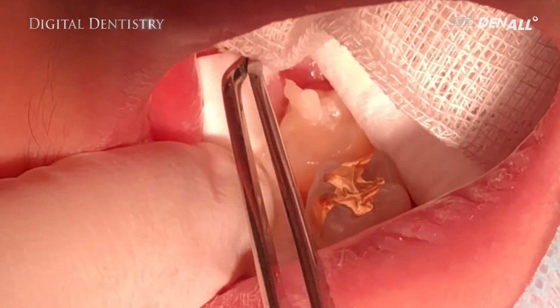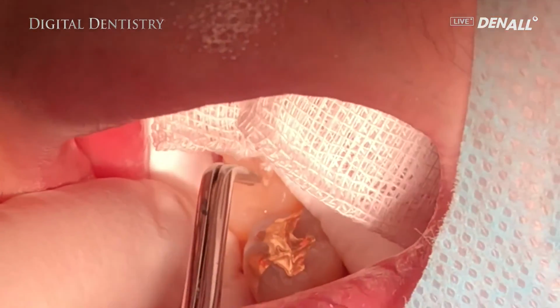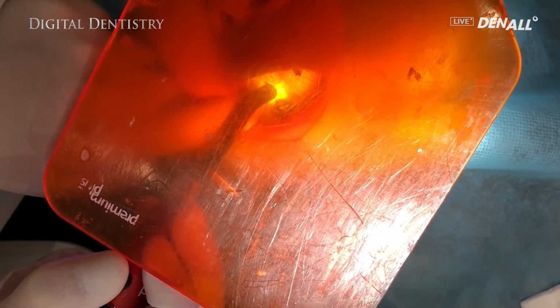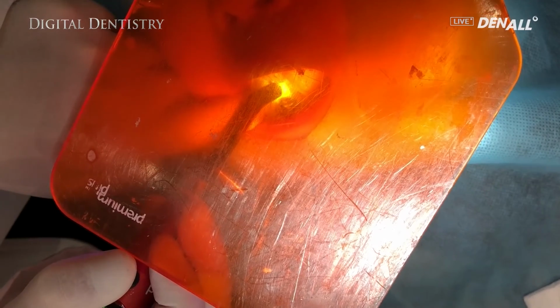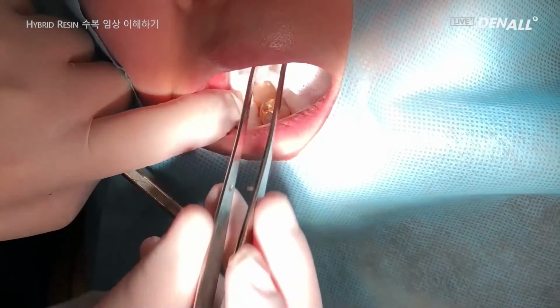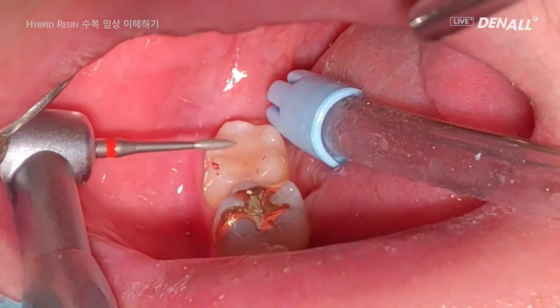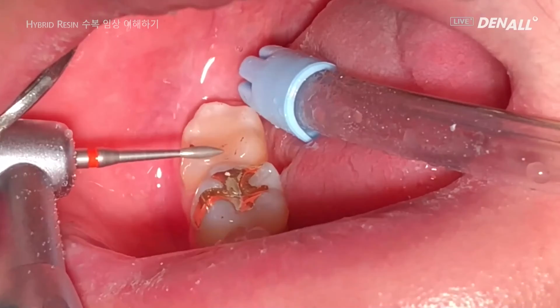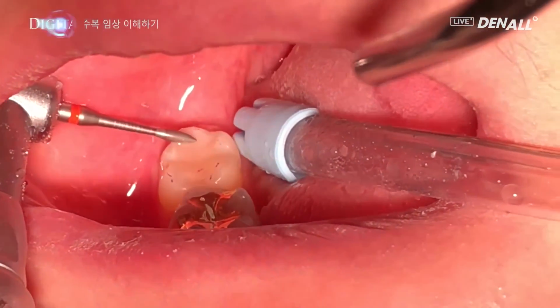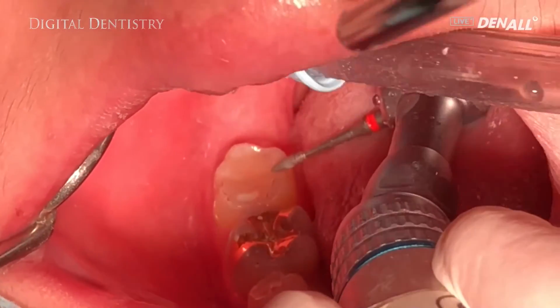You use a Q-tip to remove the excess resin cement. You press once again, and as for light curing, you do it only for 1 second. And after that, you remove the excess cement that is on the adjacent teeth and proceed with final curing. Sprue and connector are removed. Finally, check the groove and do finishing on the margin.